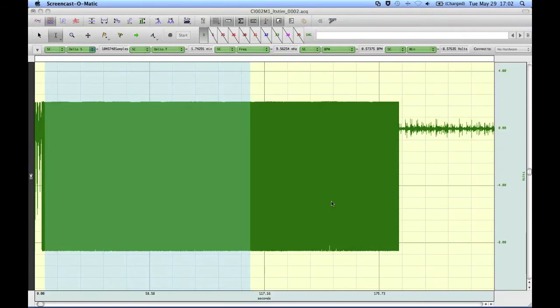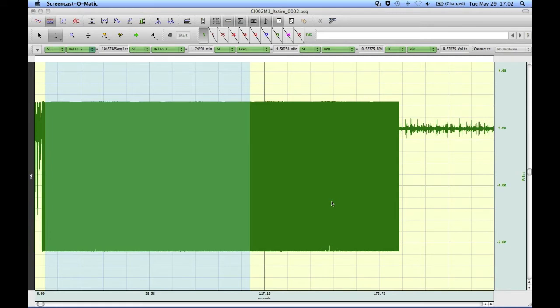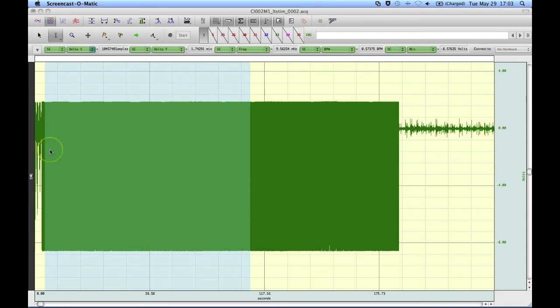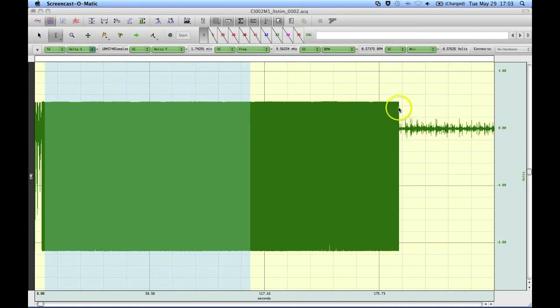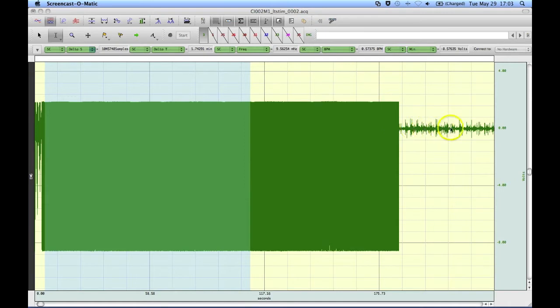The following screencast will demonstrate how to use some of Acknowledge's filters and FFT functionality to clean up an EMG signal that was recorded inside an MRI. This is the file in question and we can see there's a large band of noise while the MRI was firing and then once the scanner had stopped firing we then start to see the bursts of EMG over here.